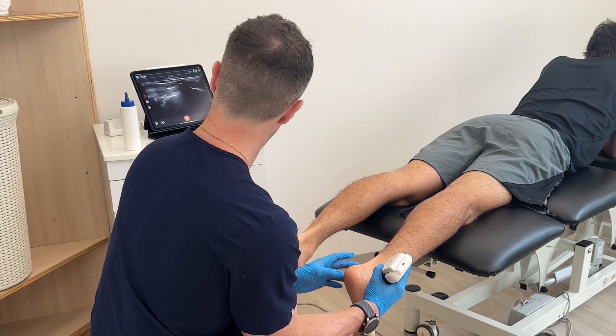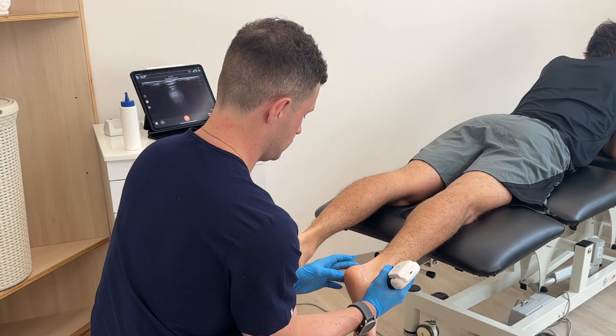In this video, I'm going to talk about the Clarius Handheld Ultrasound. Whether you're a clinician who's considering getting an ultrasound machine, or you're a potential patient who's wondering what type of gear I use in my clinic, then this video is perfect for you.